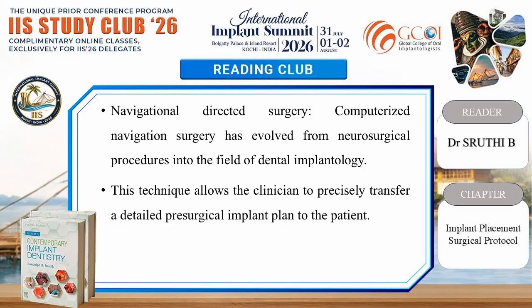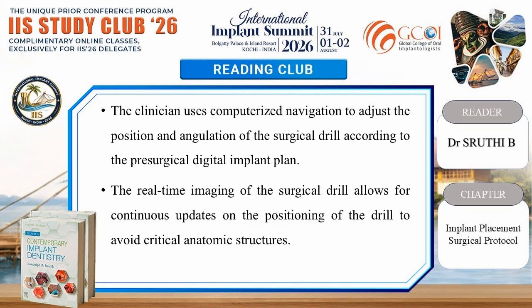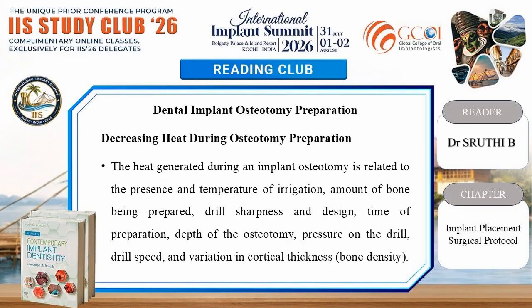Navigational directed surgery. Computerized navigation surgery has evolved from neurosurgical procedures into the field of dental implantology. This technique allows the clinician to precisely transfer a detailed pre-surgical implant plan to the patient. The clinician uses computerized navigation to adjust the position and angulation of the surgical drill according to the pre-surgical digital implant plan. The real-time imaging of the surgical drill allows for continuous updates on the positioning of the drill to avoid critical anatomic structures.